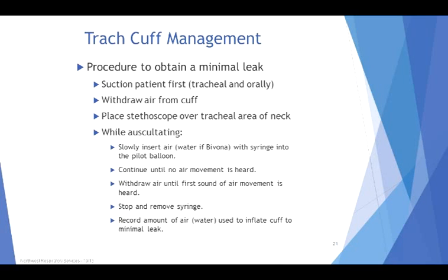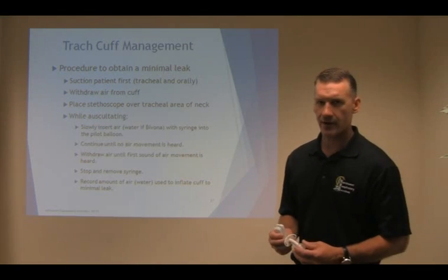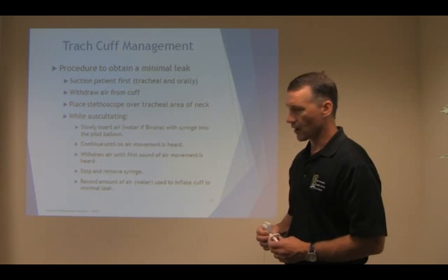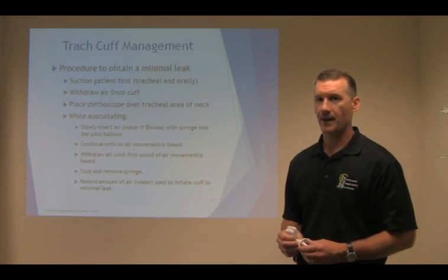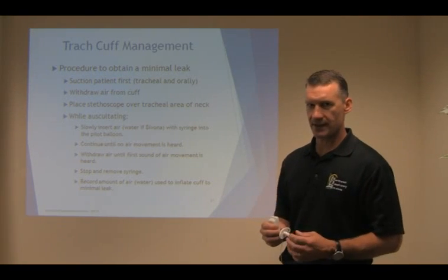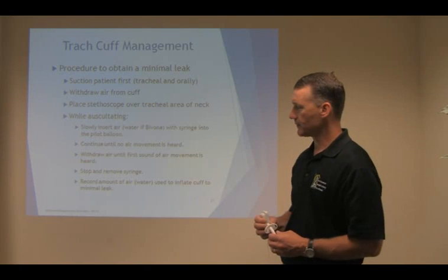Withdraw just a little bit of air till you hear the first sound of air movement. Stop and remove the syringe. Record the amount of air or water used to inflate the cuff. This is the minimal leak. And again, this is very, very important. If our customers are on a ventilator, you may have to seal the cuff completely so you don't hear any air.